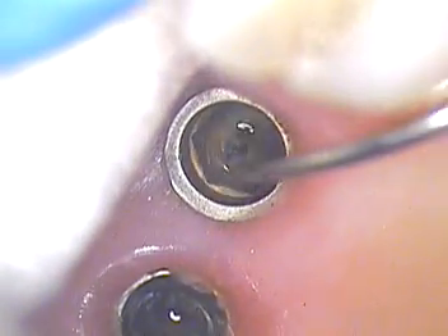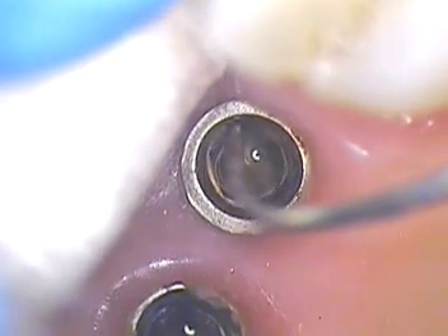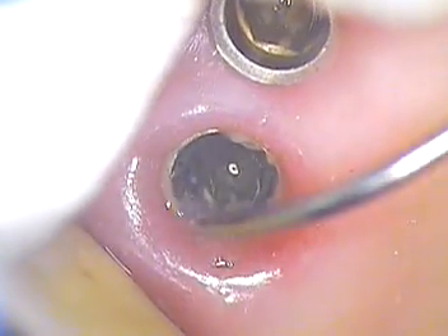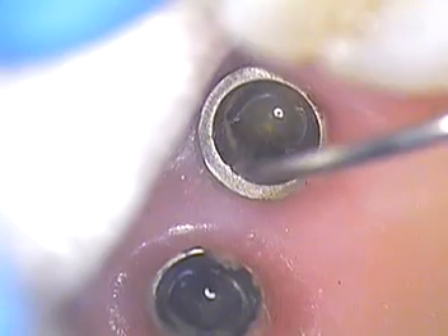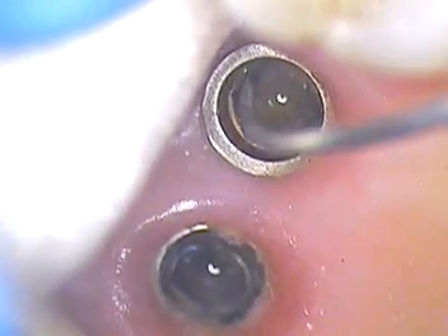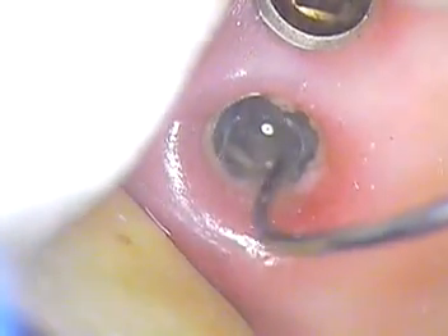We'll keep it soaking for about 10 to 15 minutes, while the other half is soaking in the same material only it's in an ultrasonic. It would be great if we could put these in an ultrasonic but we don't have that luxury. So basically we'll give it about 10 minutes, then go in with proxy brushes and try to really clean these threads up thoroughly so that they're meticulously clean.